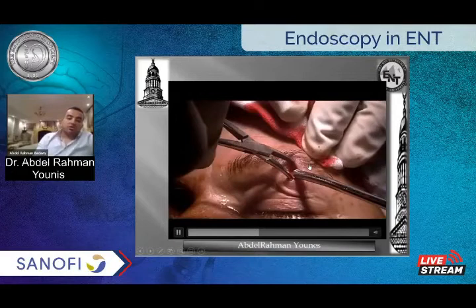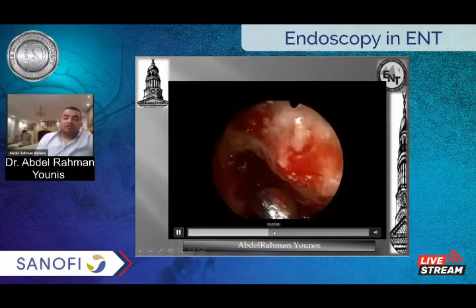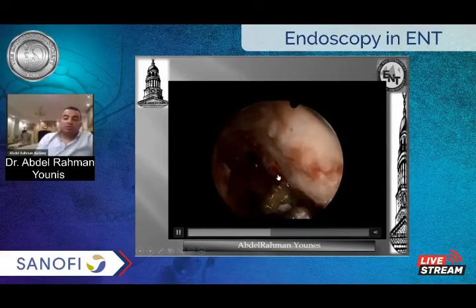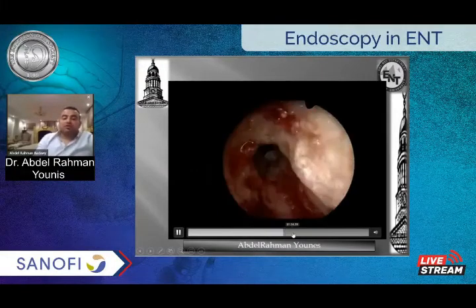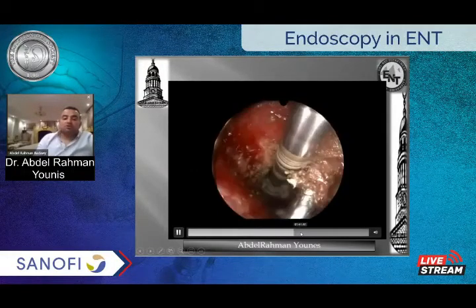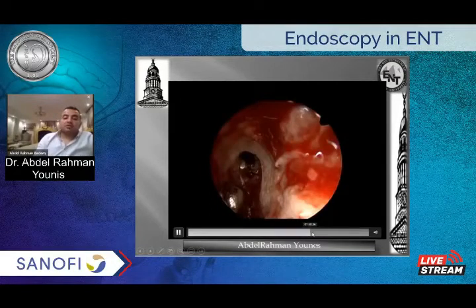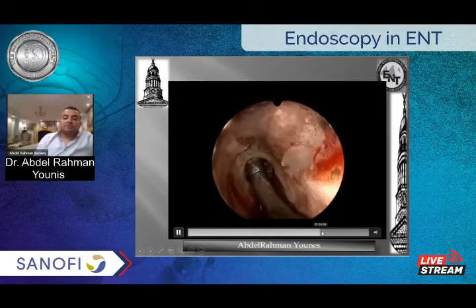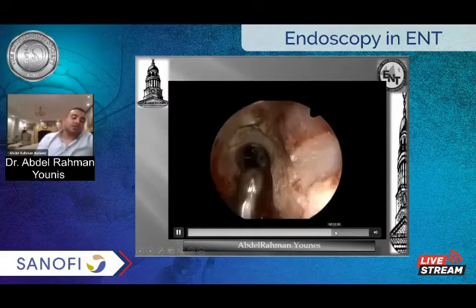So we have an incision laterally, and we go through this port using our endoscope first to irrigate, and all the fungal material comes out from our ostium, giving us an excellent visualization. And it's not only a port for irrigation and better visualization, but we can use it to insert our instrument through the external port to get an excellent view of the frontal sinus.